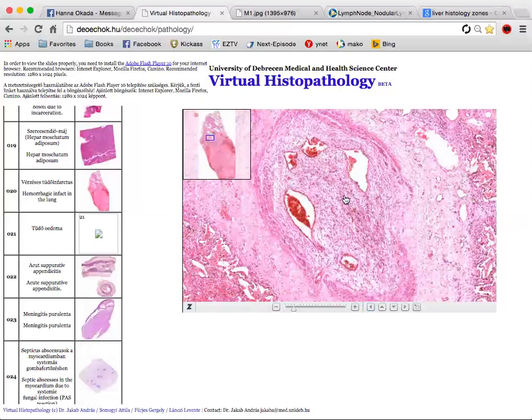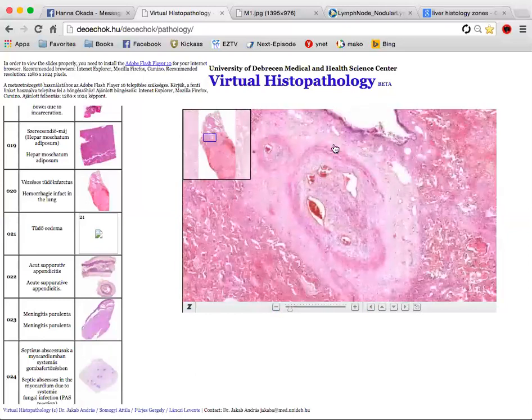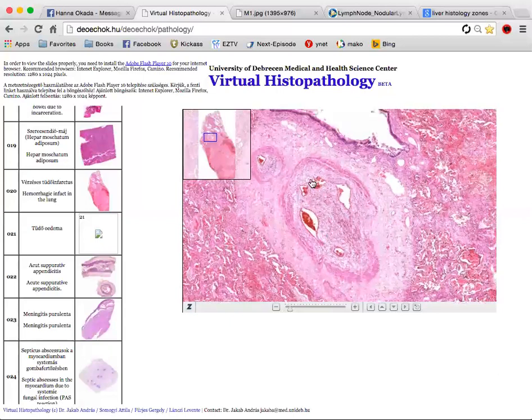So this is a fibrous thrombus, and here you can see recanalization. So this must have been long-standing, okay? This whole circle, this whole thing, is the artery. So this is an artery, and this is a smaller one. And these are just thrombi that got cut here.